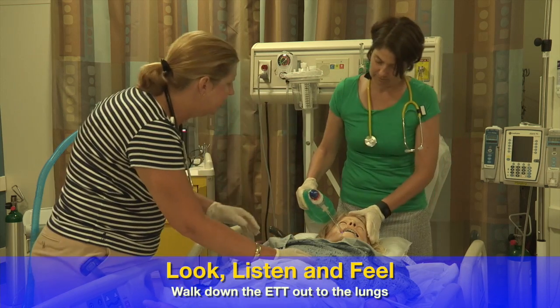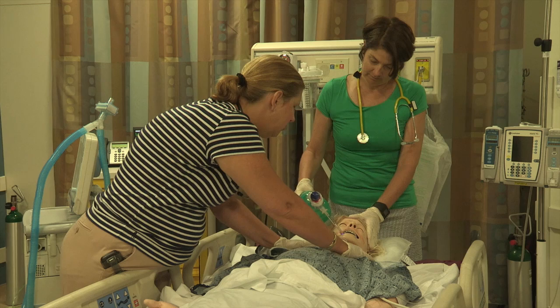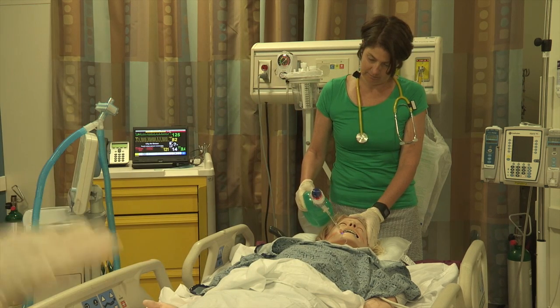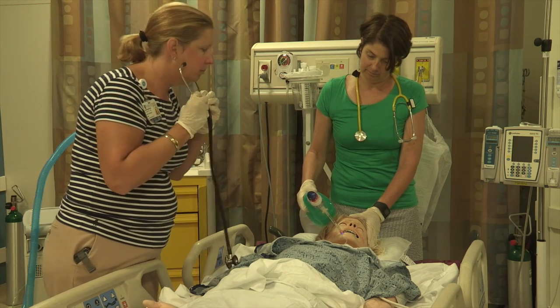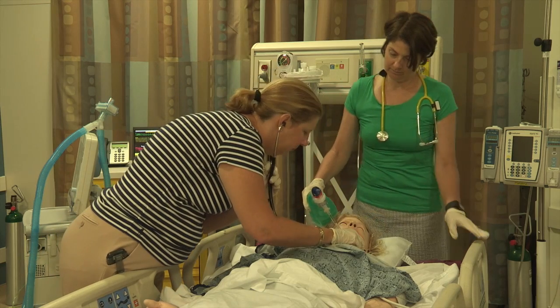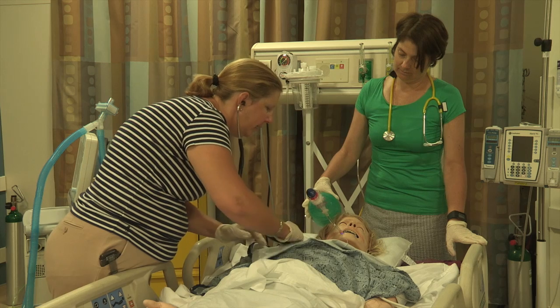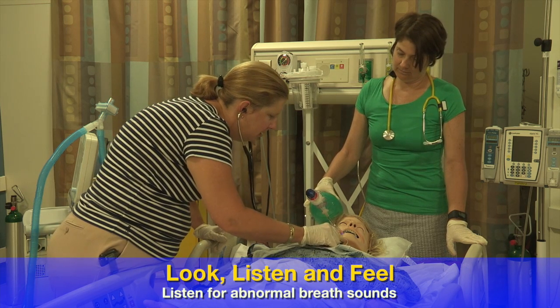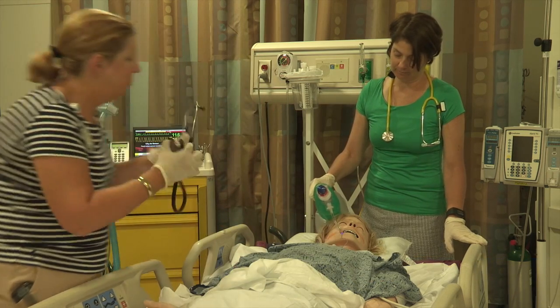While you're doing that, let's take a look and listen. When you're bagging her, the tube is taped at 20, which is where it was, so I don't think it's moved. Trachea is midline, equal chest rise, and when I look from the foot I don't see one side rising more than the other. I don't hear any wheezing, but I also don't hear any breath sounds on this right side.